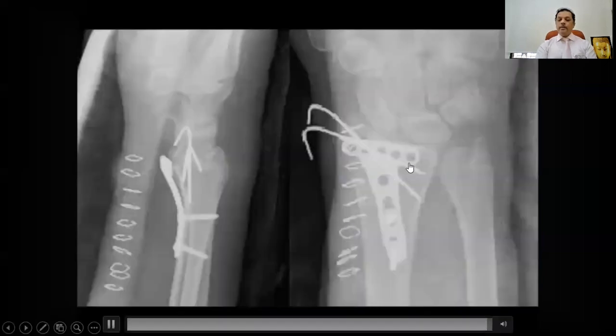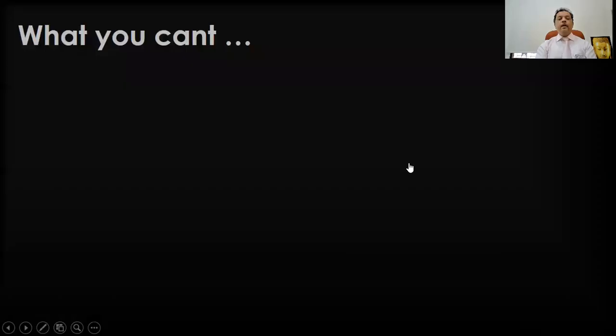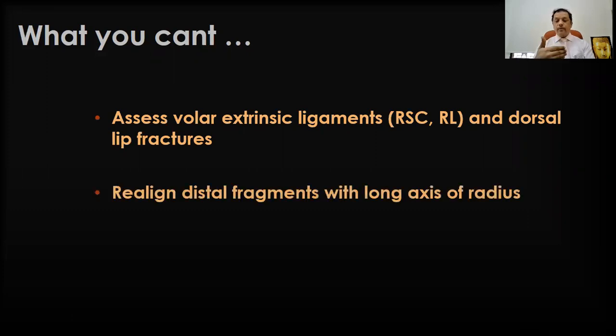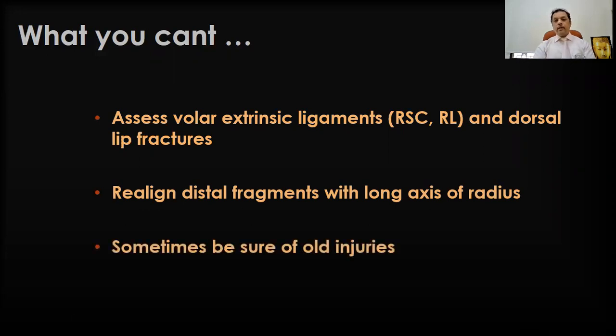This is the final picture of this patient. What you can't do is assess the volar extrinsic ligaments — the radioscaphocapitate ligaments, the radiolunate ligaments, and dorsal lip fractures. It's very difficult to go through the volar or ulnar portals to do this. You also can't realign distal fragments with the long axis of the radius by the arthroscopic route. But sometimes there could be old injuries, so you need to be sure of these things.